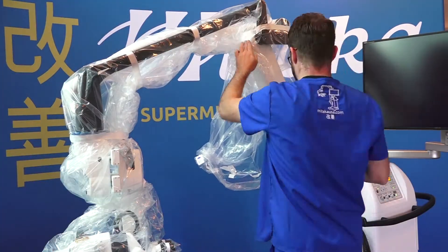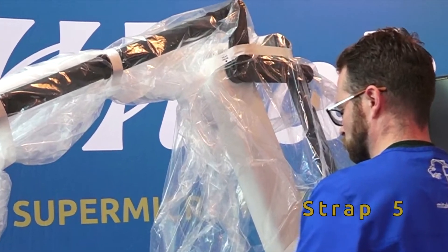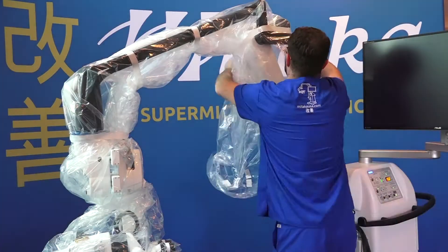The fit for strap 5 should be somewhat loose, or the strap will become undone when the microscope is moved.